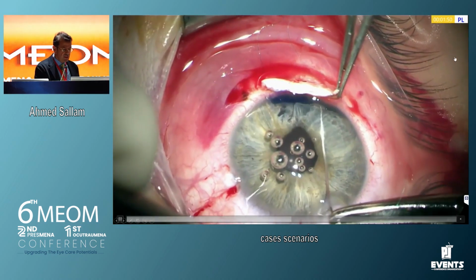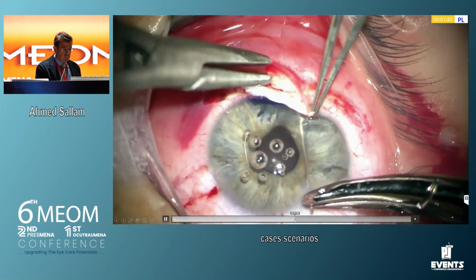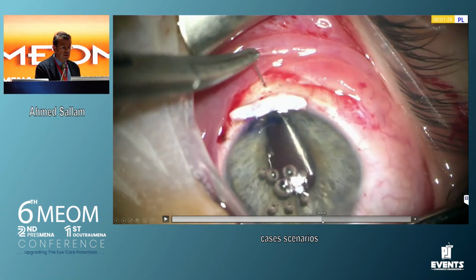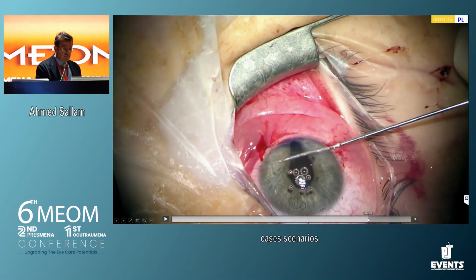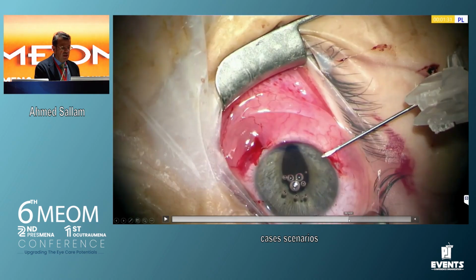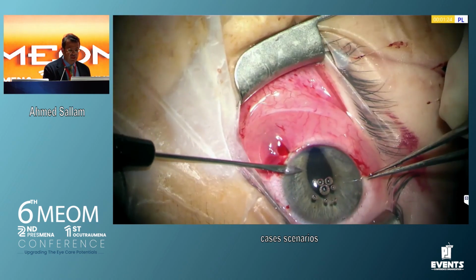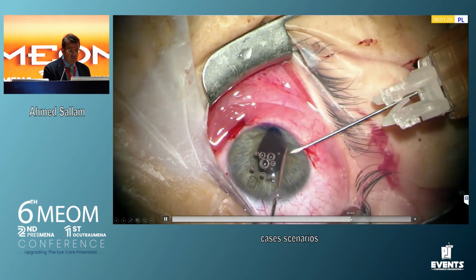And then more sutures here. And then these sutures are tied and buried. We had to repair one. The problem we found is, of course, because you got the iris this way, now you've treated the cyclodialysis, but the iris got more peaked. So just for functional, we put the iris back with 1 suture here. So just to try to get it rounded.